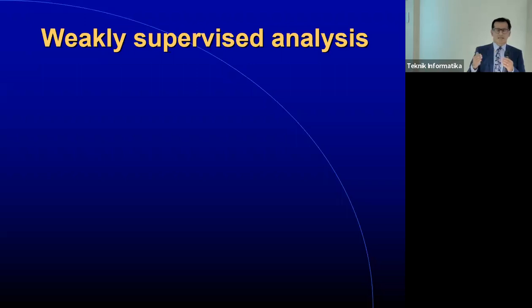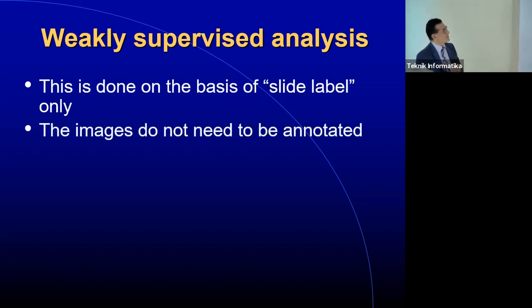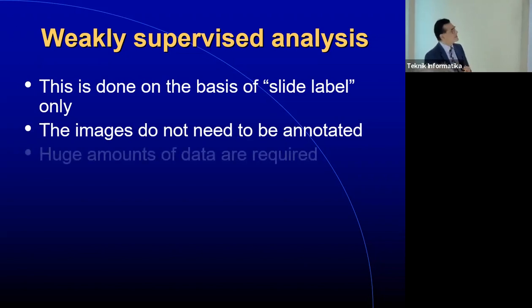We're not going to say anything other than the label diagnosis, and that's going to be the only supervision we give. So this can be done on the basis of slide label only. It doesn't need any more annotation, and the images don't need to be annotated. We'll let the algorithms extract the features that they want. But the problem is, it requires a huge amount of data.